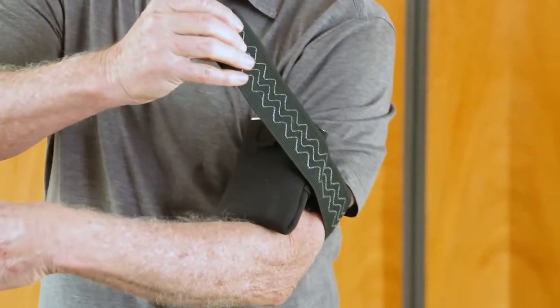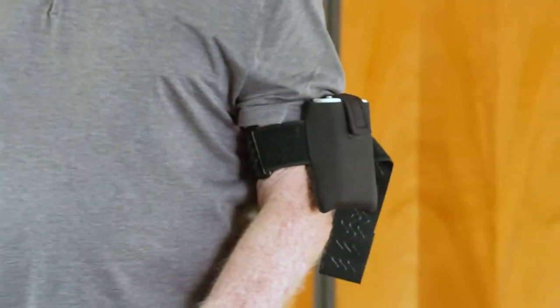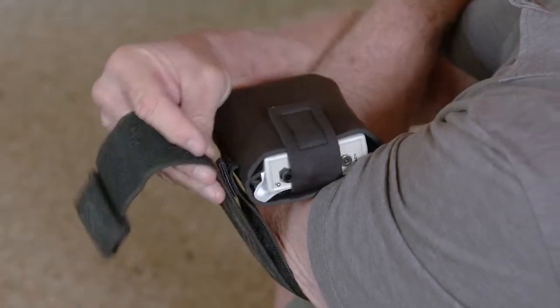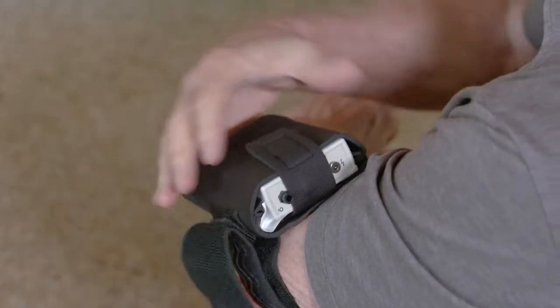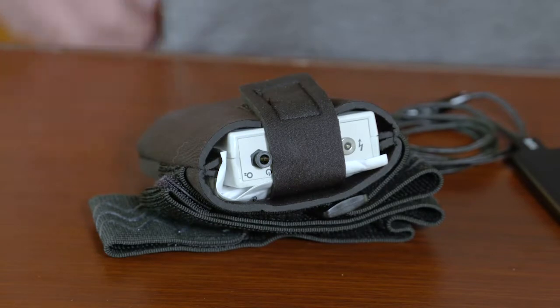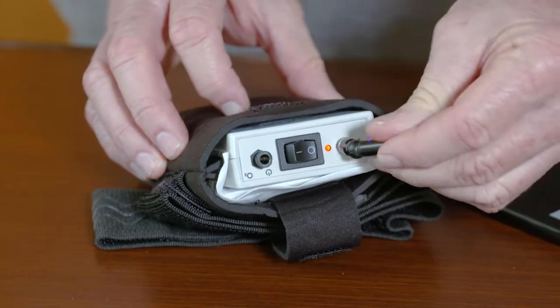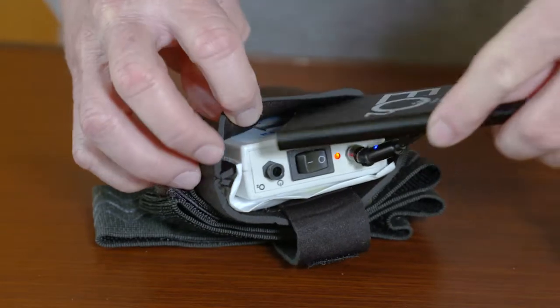To charge the Oxygeni, open the top velcro strap and connect the power pack to the charging port. You can trim any excess strap if needed. Slip the power pack into the carrying case on the front side of the device and secure the strap.